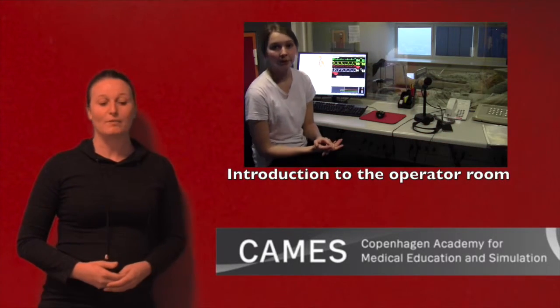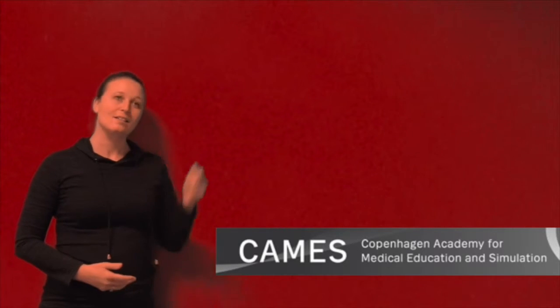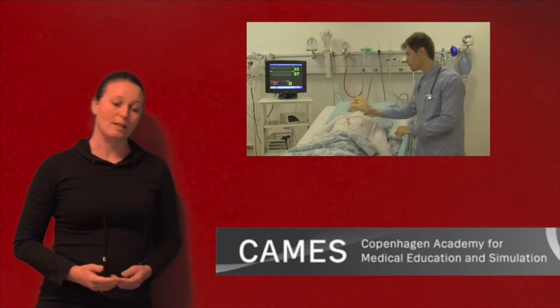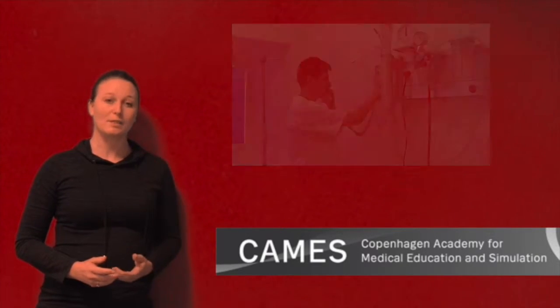First, we will give you a basic introduction to the different functions related to running a simulation scenario. Secondly, we will show you the simulation setting, the mannequin itself, and the hospital room setting. Afterwards, we will show you some short scenes from a simulation, both from the operators and the participants' point of view.